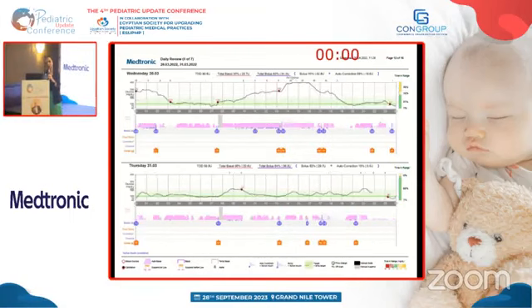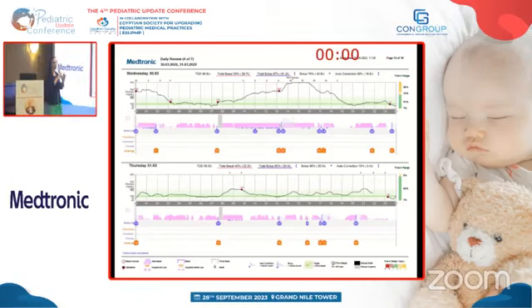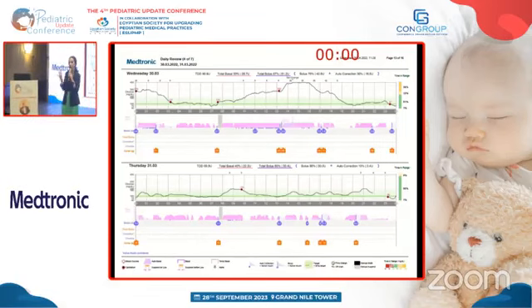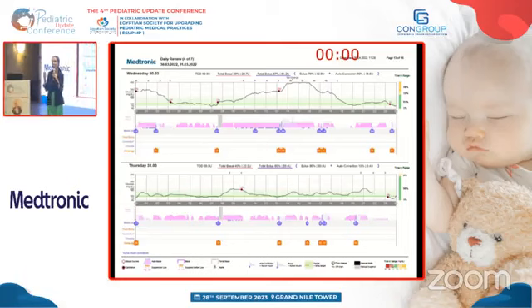هنا كان عندي في يوم اكسبشنال يوم الاربع ان هو كان عنده رايز رهيب للسكر. قبلها فوق كده في علامه الارم صغيره هنشوفها هنلاقي ان البامب كانت بتديله الارم ومسج، فواضح جدا اليوم ده كان ميعاد تغيير السات بتاعته. الارمز كتير بس هو ما كانش فيه ريسبونس.